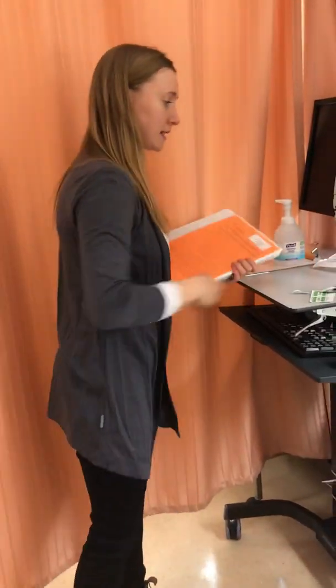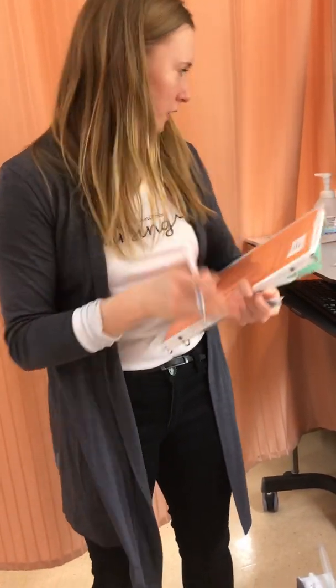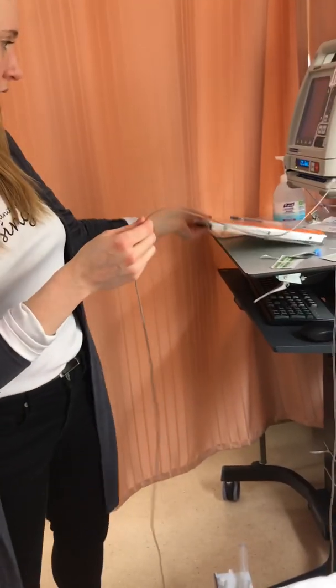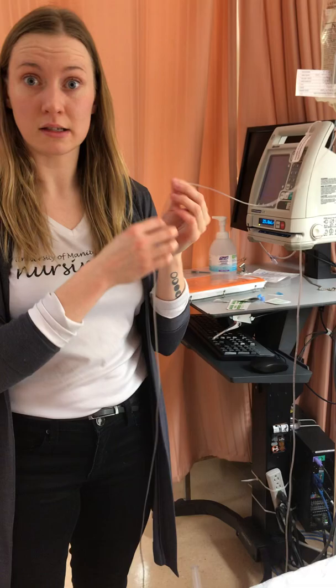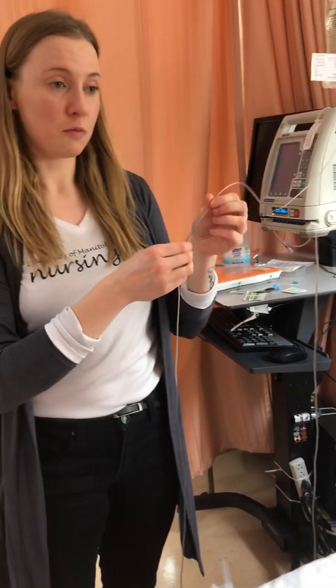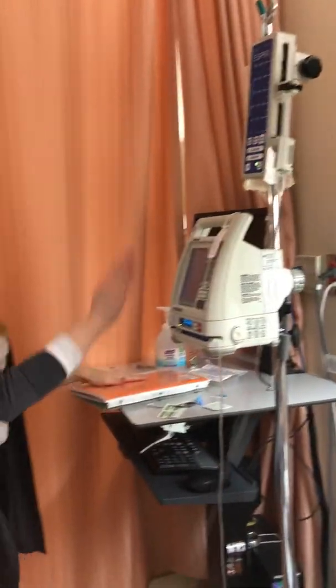I will sign my MAR that I have given this with my first and last name and the time. I'm going to make sure that I have a label on this tubing. I did write one. I think I must have dropped it somewhere. But this would be when this tubing starts, so February 11th at around 1:45 with my signature LOUMSN2. So that's signed. This is signed.